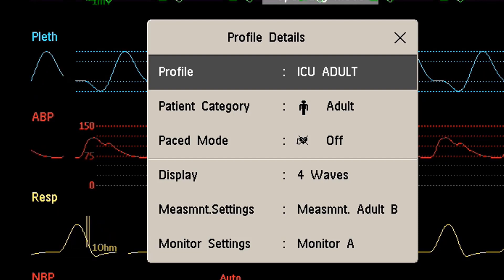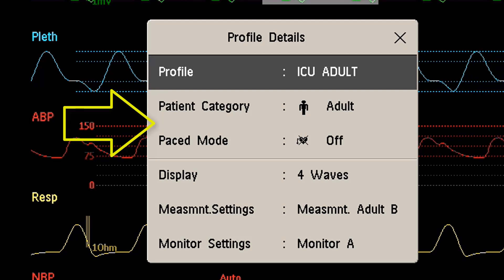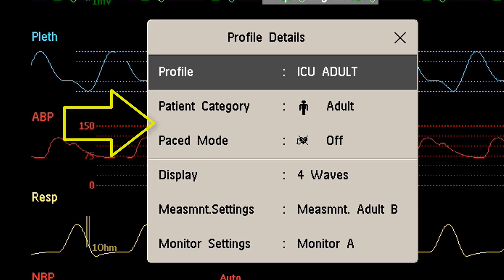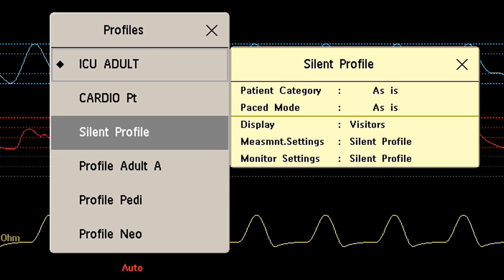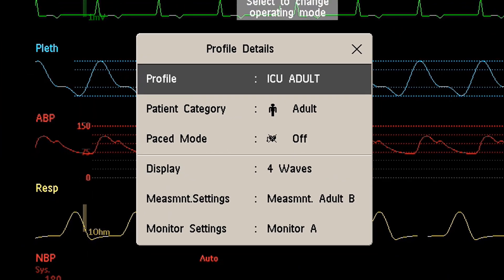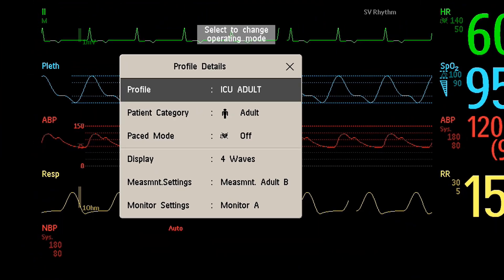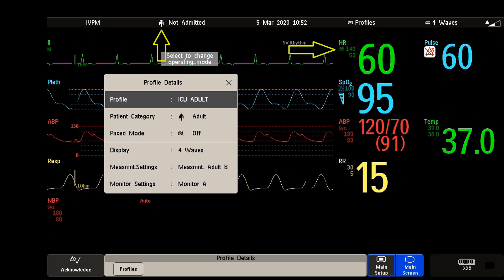If you switch to a different profile, the patient category and the paced status normally change to the settings specified in the new profile. However, some profiles may be set up to leave the patient category and paced status unchanged. I recommend always checking the patient category, paced status, and all alarms and settings when you change profiles.